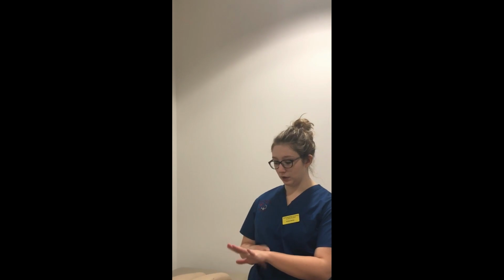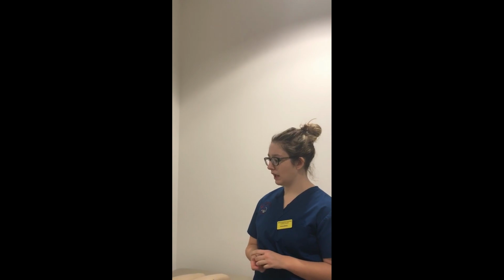Okay, so now that I'm ready to give the intramuscular injection, I'm going to come into the patient's room and make sure that I have the correct patient using 2 patient identifiers. I will look on their wristband, make sure that I have the right patient, and then I will ask the patient their birthday. I will continue. I'll ask the patient if they have any allergies.